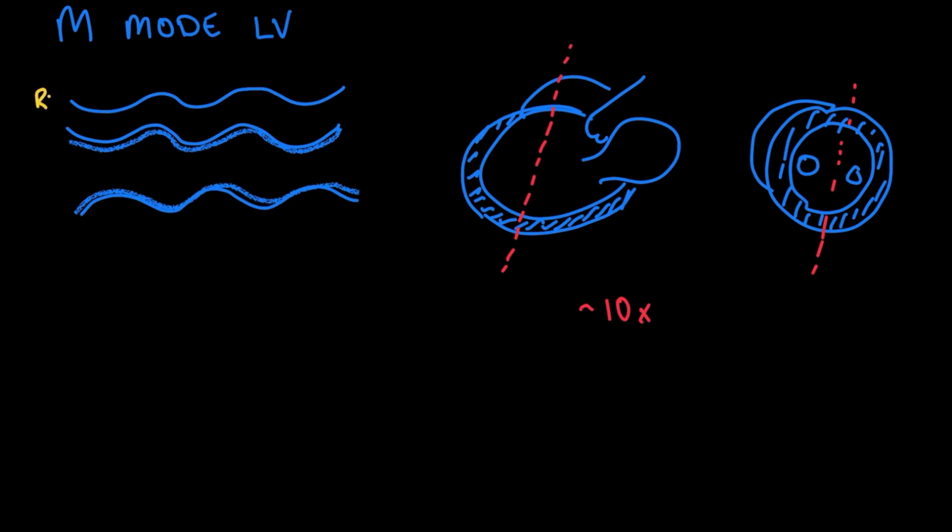This line here, that's the wall of the right ventricle. This is your septum in the middle. And this is your posterior wall down here. And you can see that it contracts in for systole, it's squeezing, and then it opens up for diastole, squeezes for systole, opens up for diastole, systole, diastole.